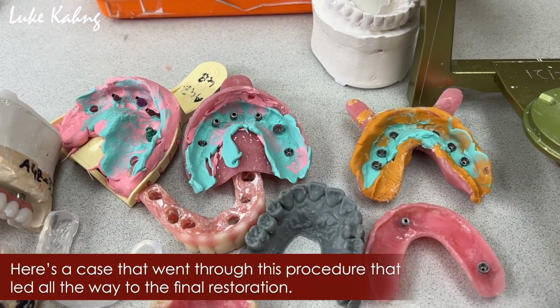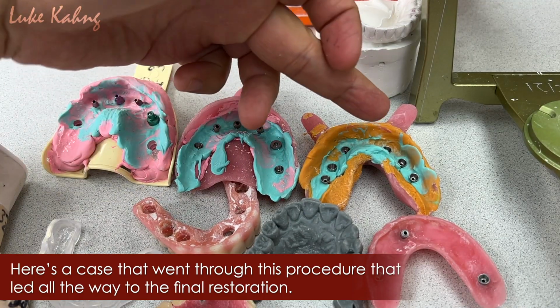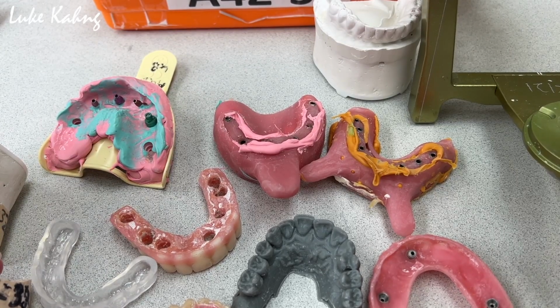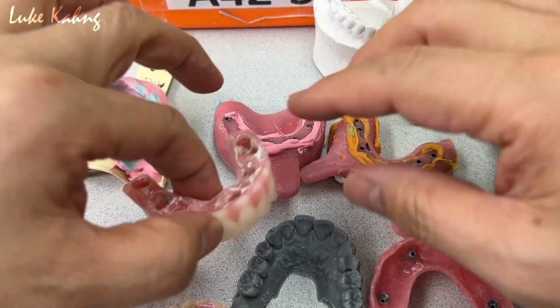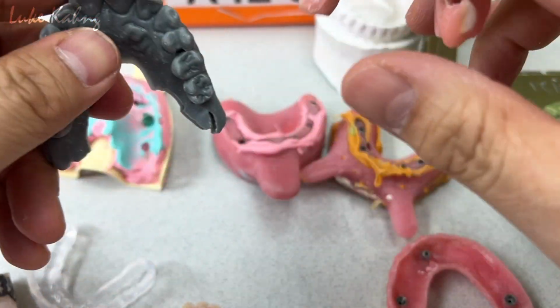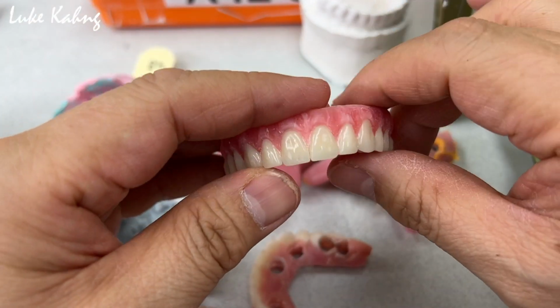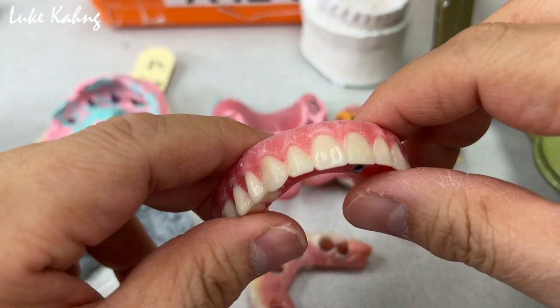Alright, this is the final regarding the big case in the 12 implant cases. This is the starting basis where the doctors made a good custom tray, which is an open tray. That's a very good idea. Okay, to get the correct impression to make the tissue model. They do have a PMMA conversion from these natural teeth, so they extract all those things out. So we made the verification jig and also wax rims such as like that. That's from the upper and lower. This is the guidance, and then they try it in the patient's mouth and just make sure with the patients.